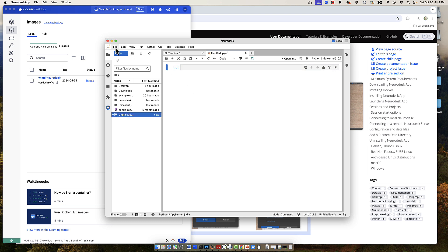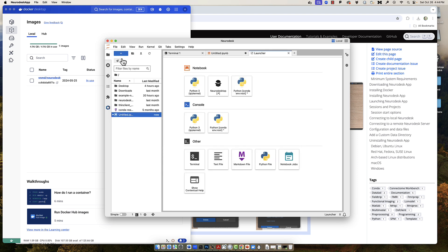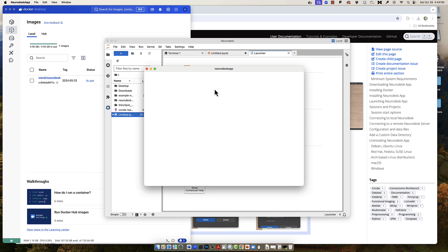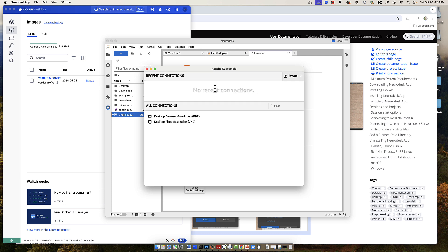Notice that all of the items in the left panel display folders you can navigate to and different files you can open. If you click on the Neuro Desktop launcher icon right here, it will open a new window giving you a couple of different options.